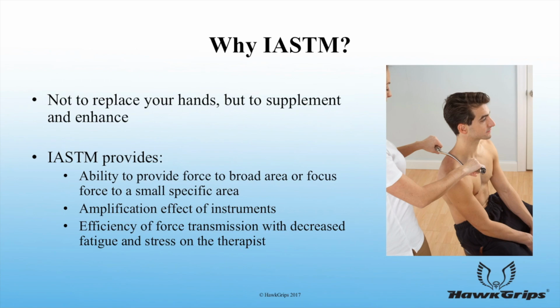IASTM is not designed to replace your hands or eliminate manual techniques, but rather to supplement your treatment. The instruments will provide the ability to provide force to a broad area or focus the treatment force to a small specific region. The instruments will also help to specifically identify tissue restrictions by increased vibration of the instrument during a treatment stroke when restrictions are present in the soft tissues.